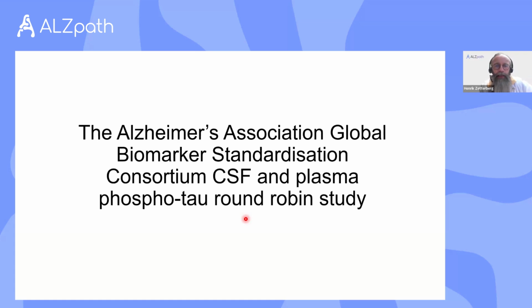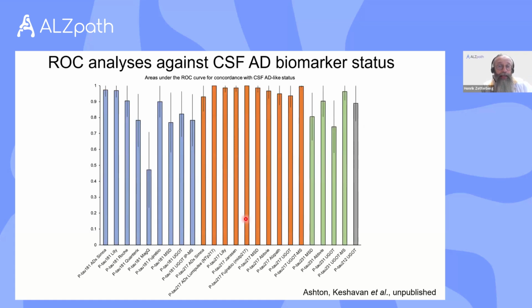But anyhow, here we can see that again, it looks like the phosphorylated tau, the pTau assays that detect tau phosphorylated at amino acid 217 tend to perform a little bit better than the other assays, but this is marginal, of course. And you see then that, for example, the ALZpath assay in this direct comparison comes out as a very top performing assay.